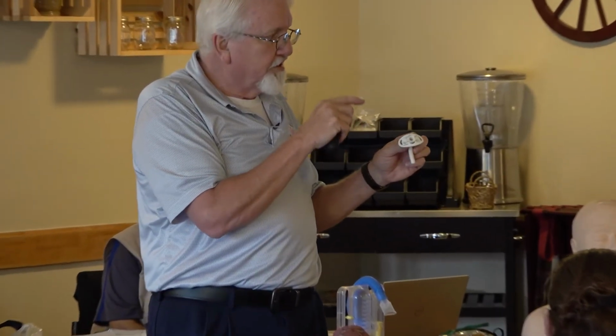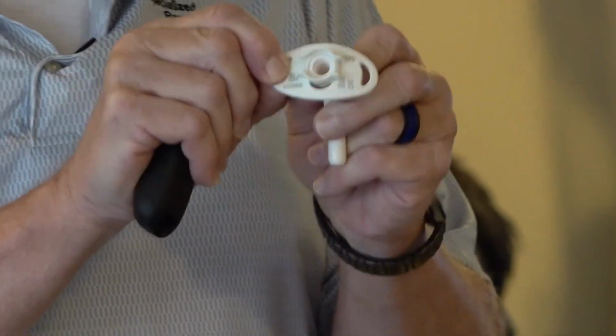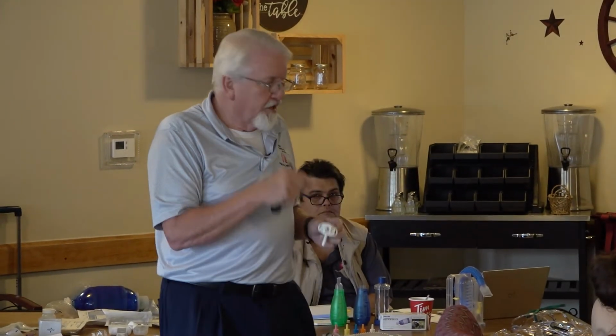Okay, and so if you guys are ever the ones to remove the sutures, bear in mind, typically top and bottom are also connected. Okay, so it's not going to be one and out, because if you go one and out, you're pulling that one too because it's connected. So your 2 sides, top and bottom, typically are going to be connected from top to bottom. So that's going to give you your 4 sutures.